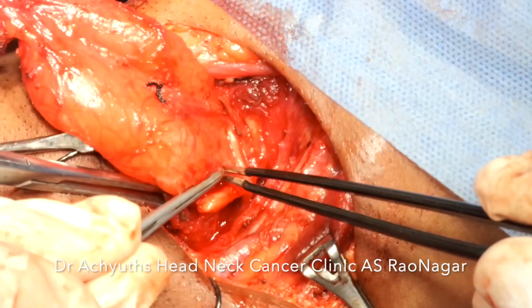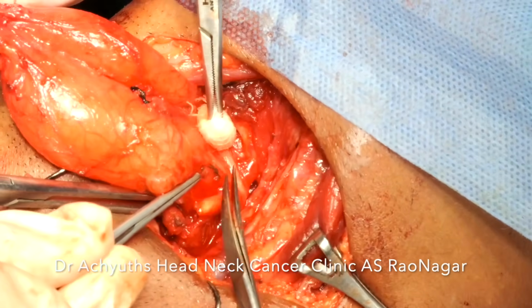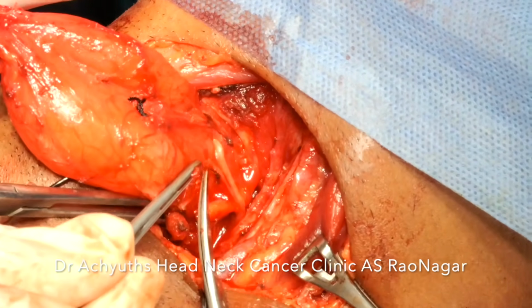So the greater cornua is being detached from the attachments.